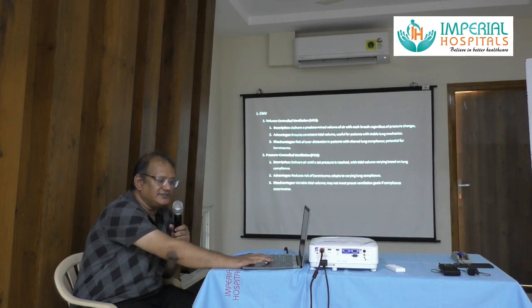So what are the advantages? Because the pressure that is reaching the lungs is going to be set, there is a very low risk of barotrauma per se. Disadvantages, tidal volume can vary. So if the lung is not compliant at all or has reduced compliance, in those cases, the tidal volume we require may not be delivered to the patient.